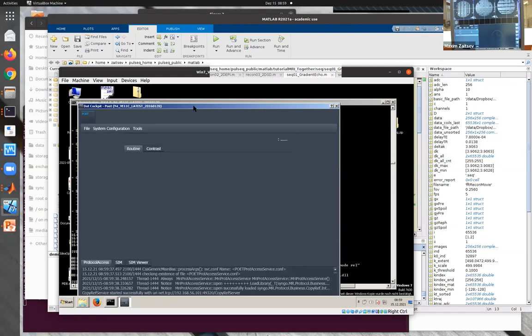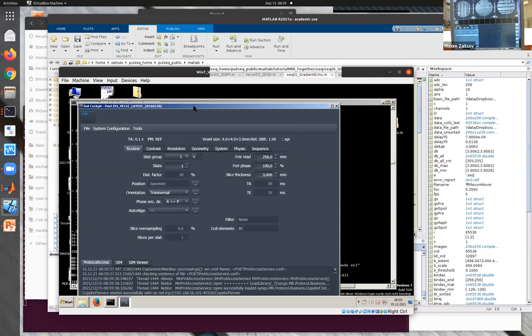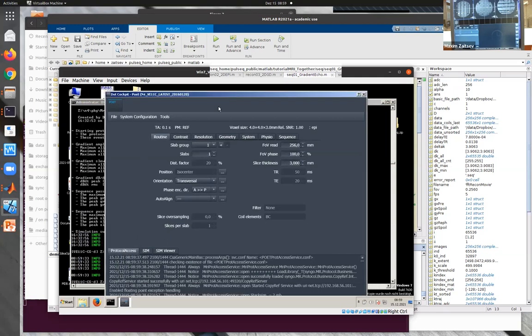Okay. So here you can basically change the orientation, and the other parameters are all not used. In the earlier versions, I actually tried to disable them, but it's really very easy to get the scanner upset if you disable the parameters which it expects to be alive. So we stopped doing that.